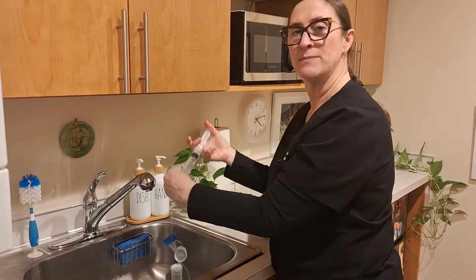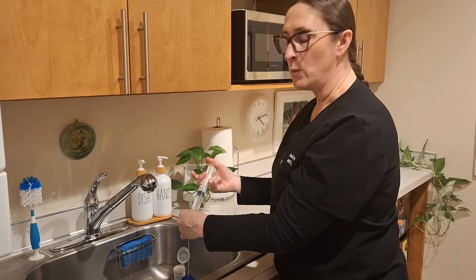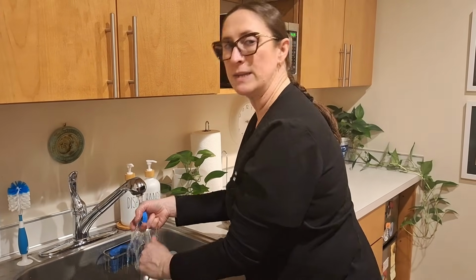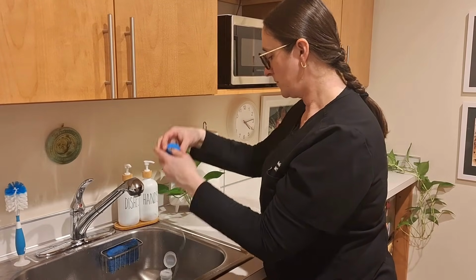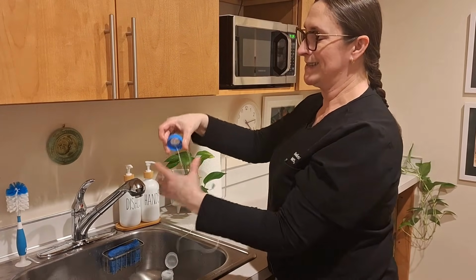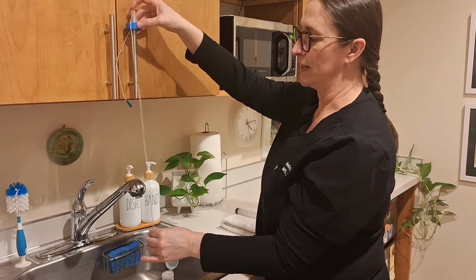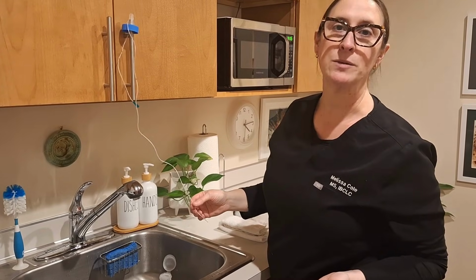The tubes that are less expensive will generally last a half week, a week. Once they feel stiff or they're no longer very pliable or you feel like it's not clean, then it's time for a new tube. So we'll get it cleaned out, wash it up, and then you can decide. Sometimes I circle it around. You can hang it up to dry for the next feeding, and you can also discuss how often they need to be replaced with your lactation consultant.